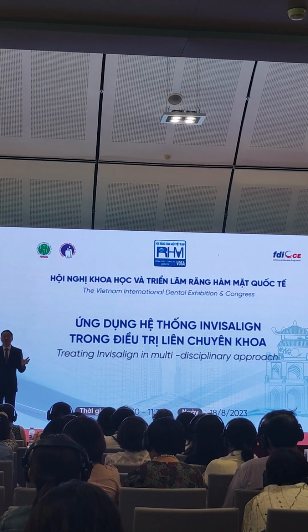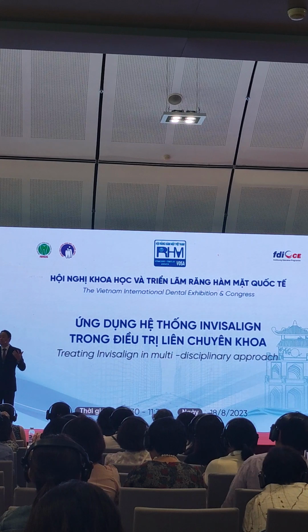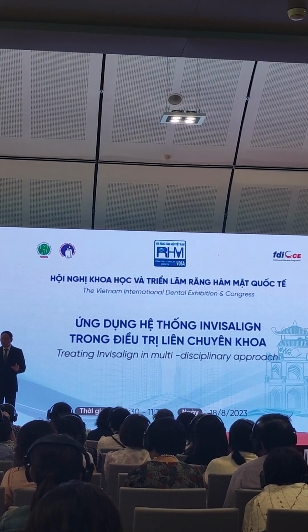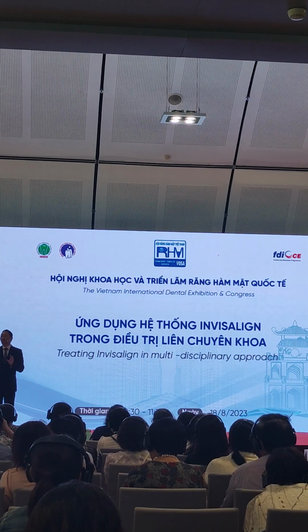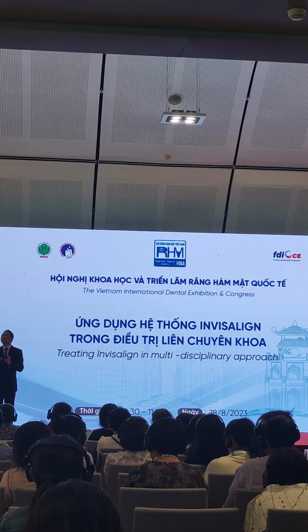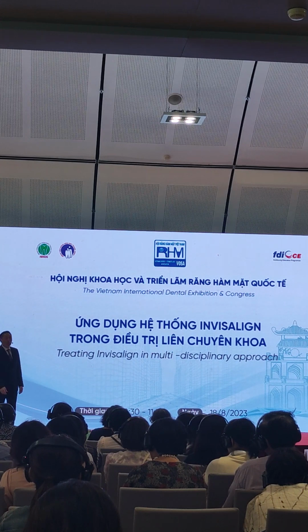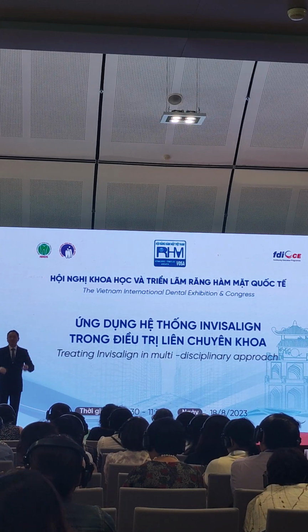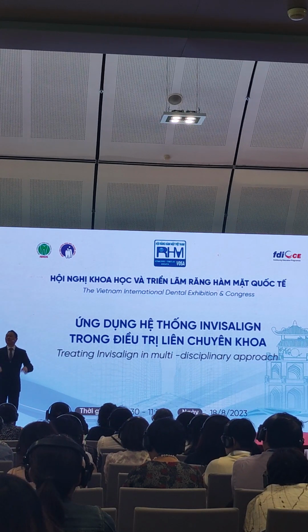This is what we need to do: relax the muscle, find the central relation, and then restore the occlusion. Actually, orthodontic movement is just like a full mouth rehabilitation. And about elastics, Class 2 traction usually helps because it moves the jaw forward to reduce the pressure from the condylar elements.